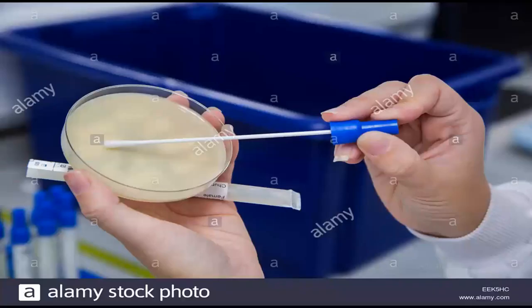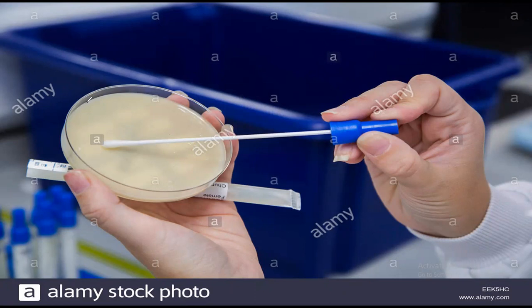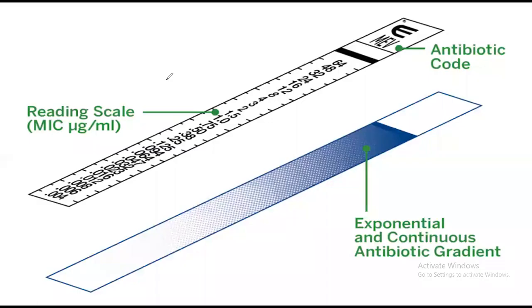After that, take the inoculum. Take a sterile swab — this is the swab that is used in microbiology labs — and dip it in the blood or inoculum. Take it out and streak the inoculum over the media. Make sure you cover all the surface of the media, including the edges and the middle area. You will rub the swab over all the area of the plate.